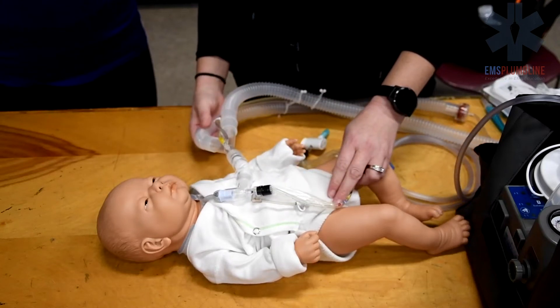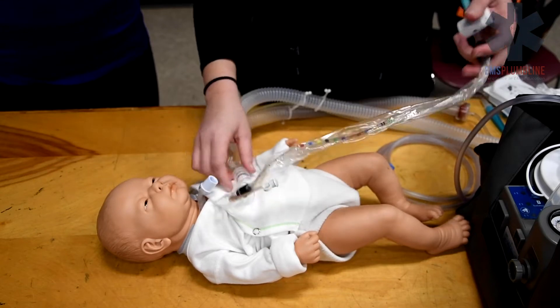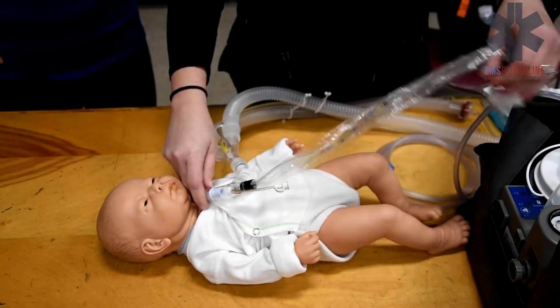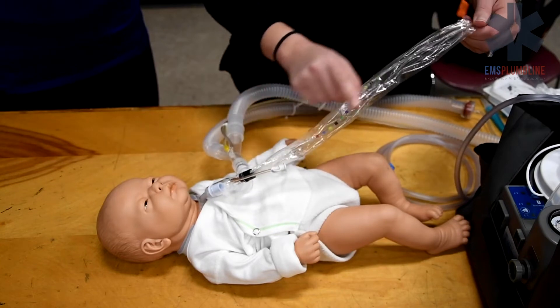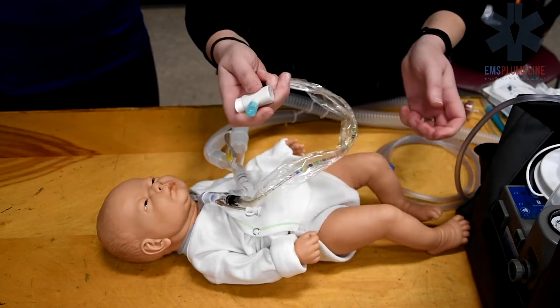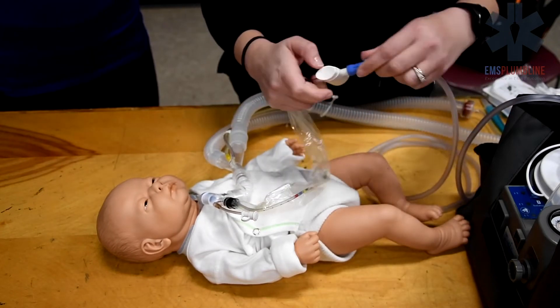When suctioning with a ventilator, a closed suction catheter or a Ballard suction is attached to the ventilator circuit. A Ballard suction has a clear plastic sheath around the catheter, keeping it sterile. A Ballard suction catheter can remain attached and does not need to be replaced with each suctioning session.